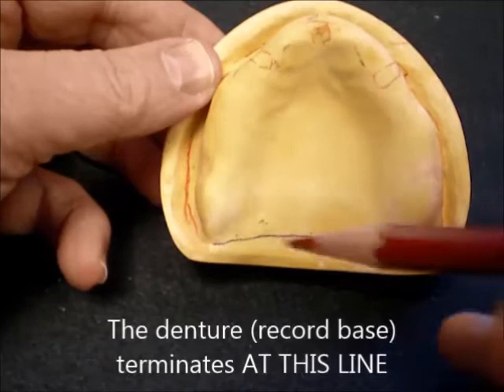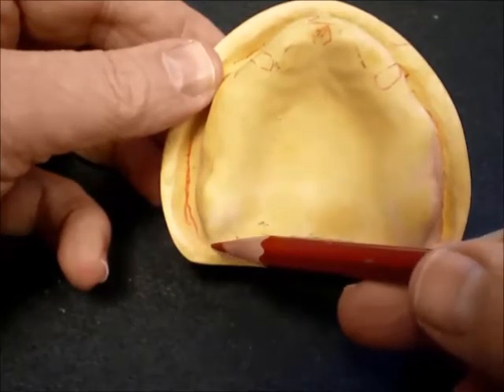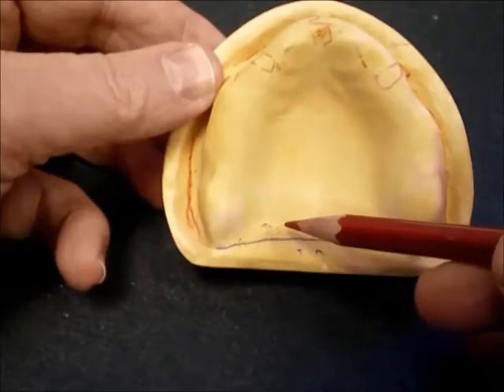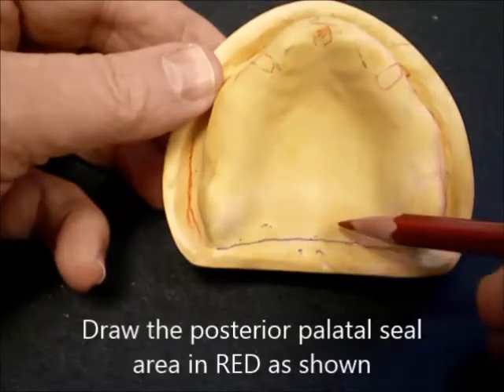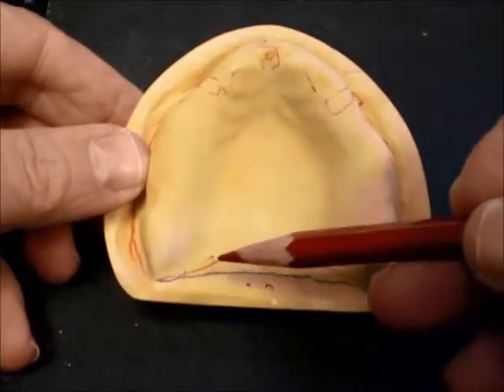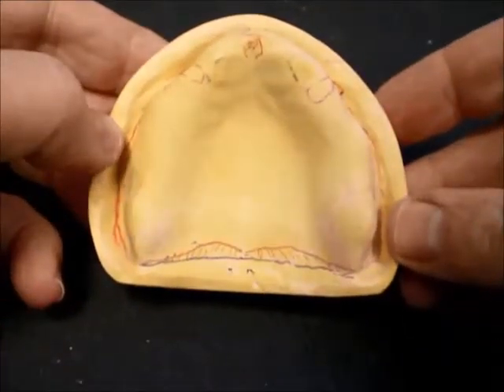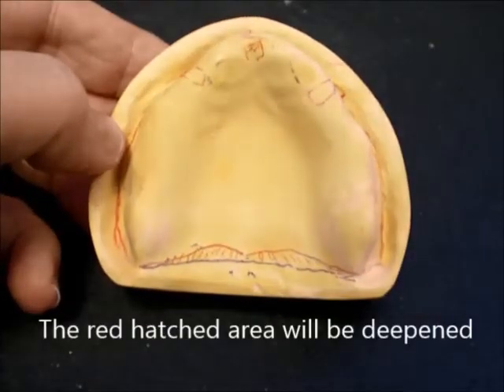The denture base terminates at this line and does not extend beyond it. Now the red pencil is going to be used to outline the posterior palatal seal area. In this hatched area, the stone will be removed and this area will be deepened.